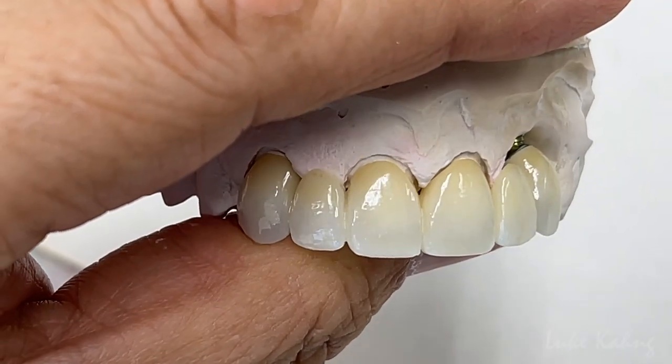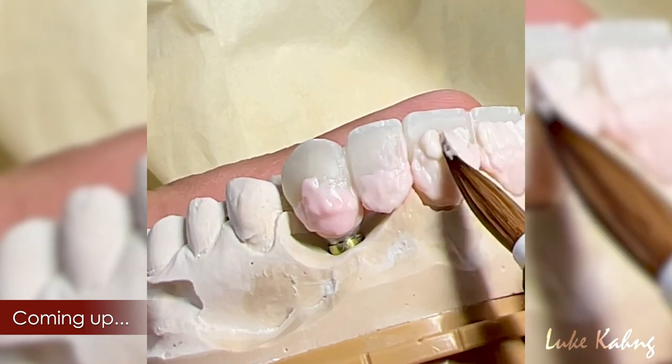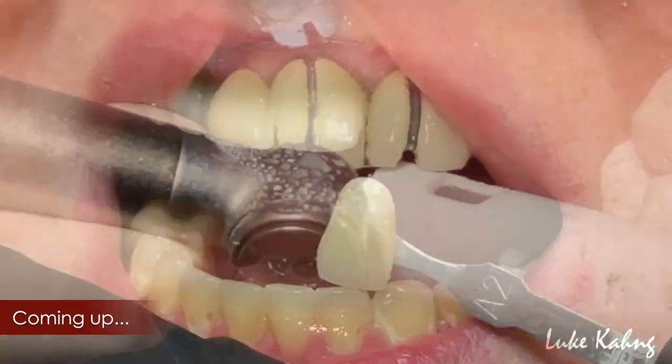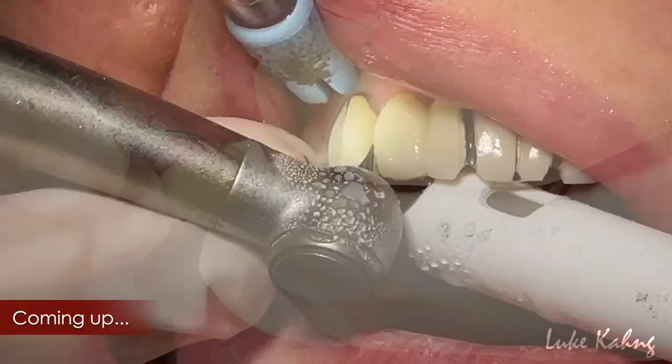Now this is final — a custom interior 6-unit prosthetic. We went through the previous build-up, scanning, design, and tissue management. Now we want to see the try-in in the patient's mouth.